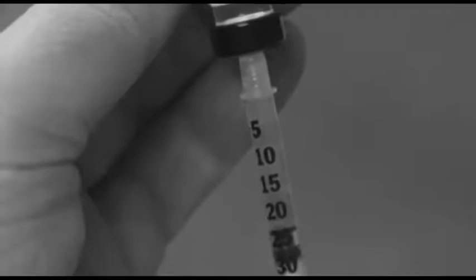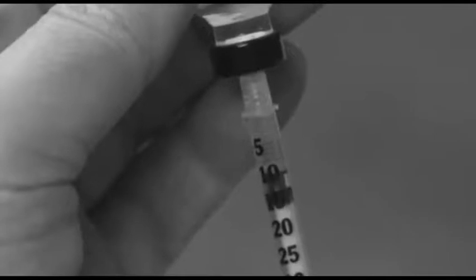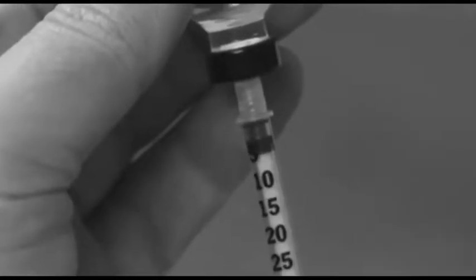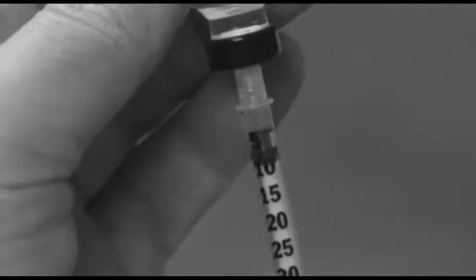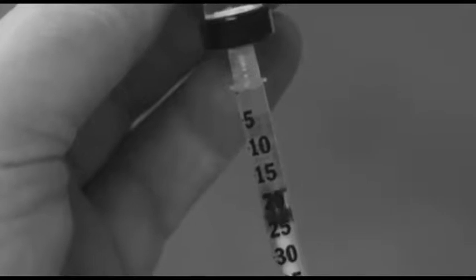So before removing the needle from the bottle, look for air bubbles in the barrel of the syringe. If you see any air bubbles, slowly push the plunger until all of the insulin is back in the bottle. Then redraw the insulin more slowly. Continue to check for air bubbles as you go. Repeat these steps until there are no air bubbles in your syringe.